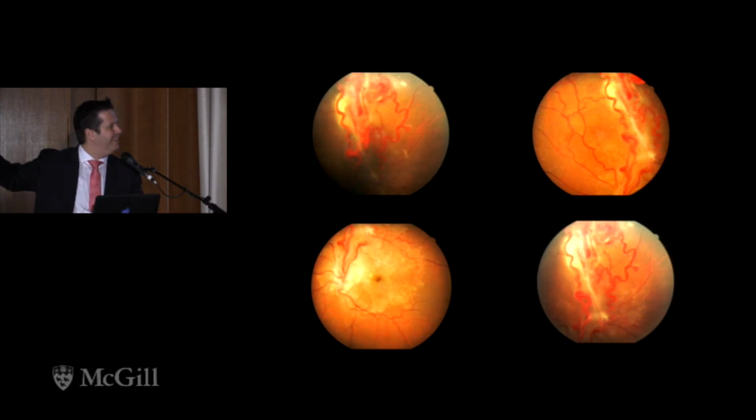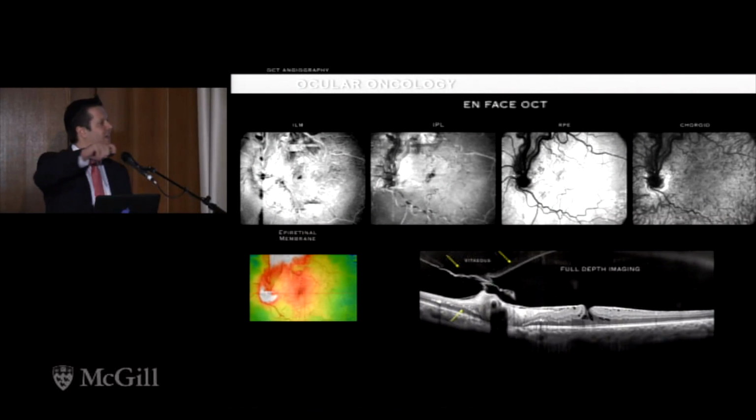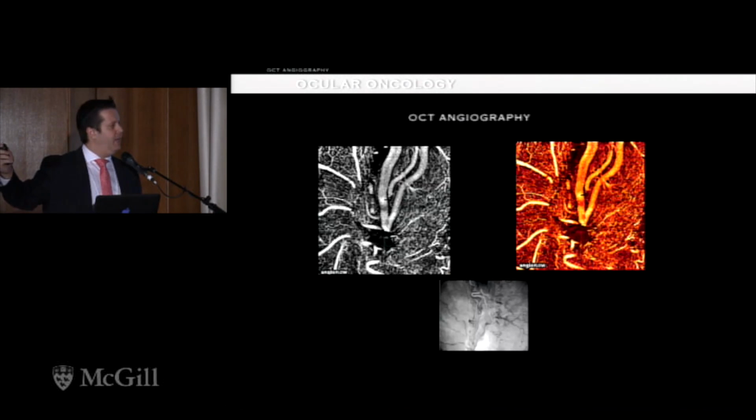You can see a patient with VHL very nicely, with the details. This is the ultra-fast image. So what do we see in the full depth imaging? We see the vitreous very nicely. We see an epiretinal membrane and some vascular details. We can see some vascular exudates or something like this in this area. The quality of the image was very nice. But most important, with the ultra-fast scan, we see the epiretinal membrane affecting the retina in a very bad way.